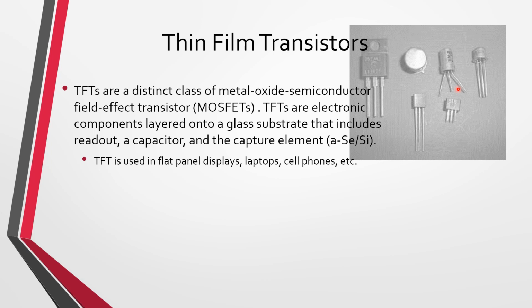TFTs, however, are a distinct class of metal oxide semiconductor field effect transistor, which is MOSFETs. TFTs are electrical components layered onto a glass substrate that includes the readout, the capacitor, and the capture elements, which could be amorphous selenium or silicon. TFTs are used in flat panel displays, laptops, cell phones, so TFTs are everywhere. And you may not have even realized the technology that allows flat panel displays and laptops and cell phones is TFT technology. So TFTs are incredibly thin.